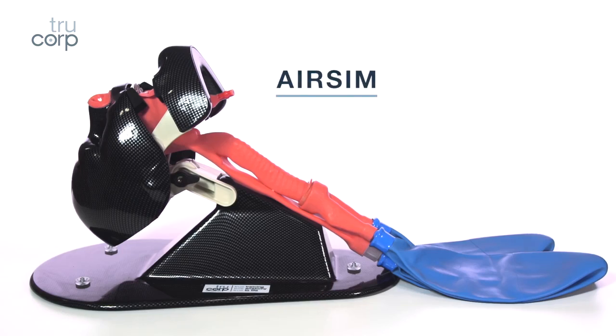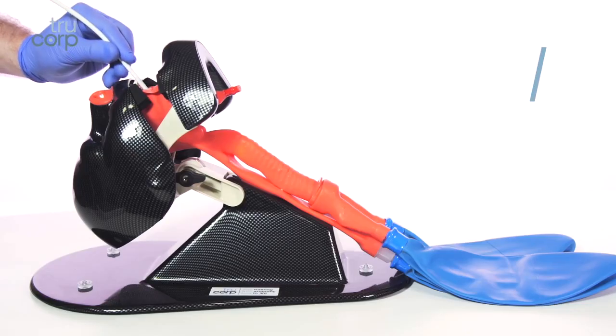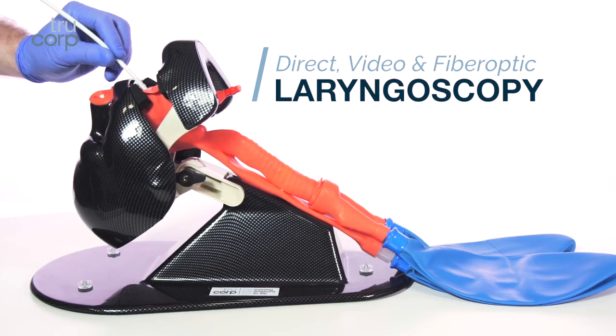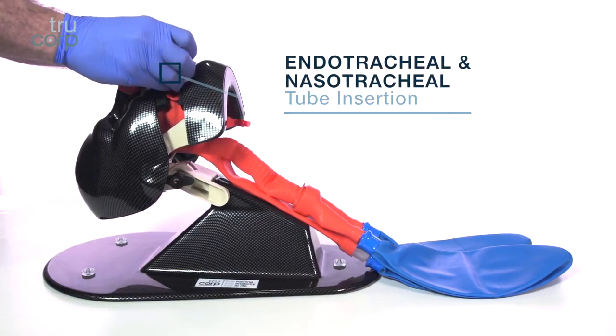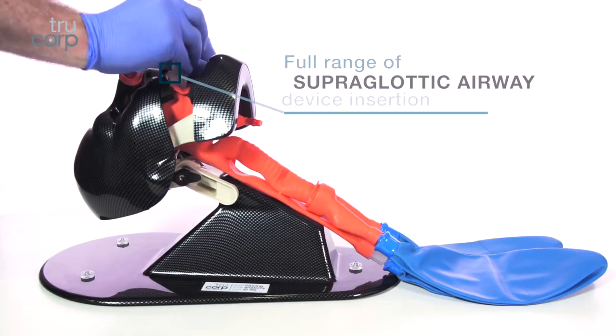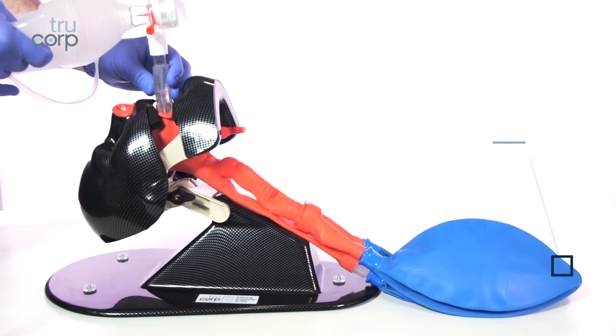AirSim, Naso and Oral Airway Management Trainer, suitable for training in awake fiber optic examination, direct and video laryngoscopy, endotracheal and nasotracheal tube insertion, full range of supraglottic device insertion, and single lung isolation techniques.